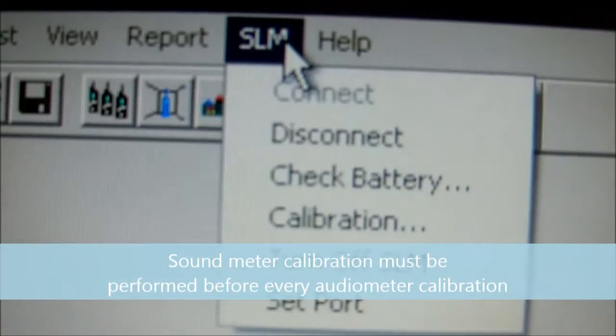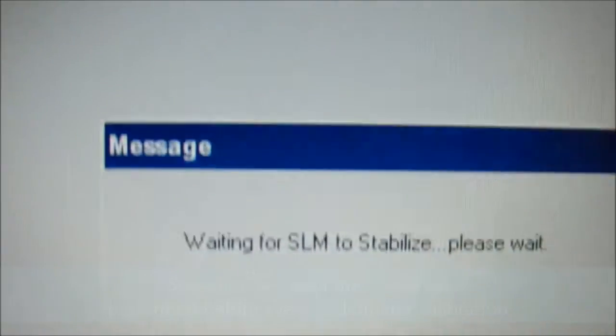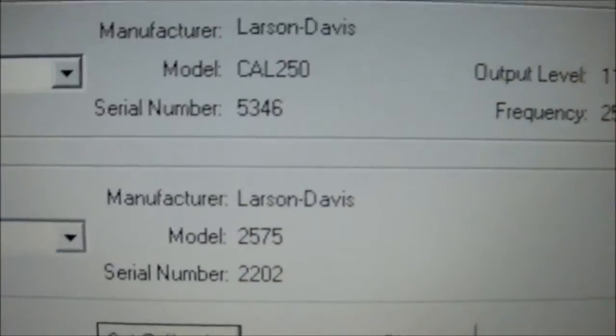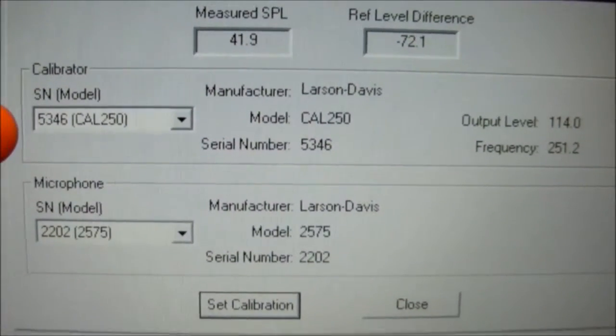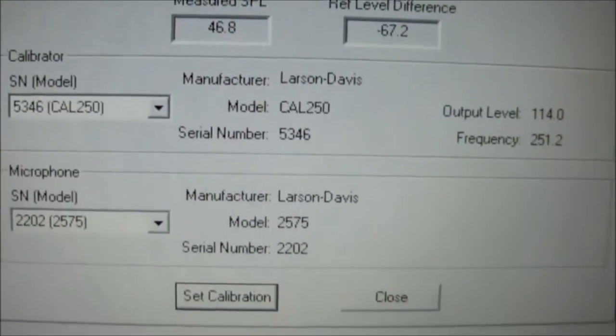Click SLM and select calibration. It's waiting for the sound level meter to stabilize. Here from the drop down box it's already pre-selected, but we would select our Cal 250 calibrator and our microphone.